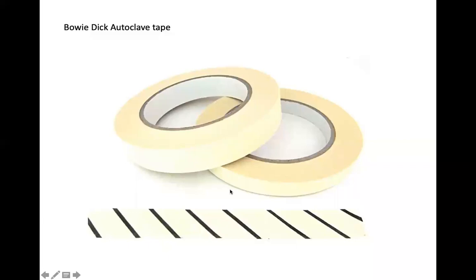And you use this, if you've gone through theater, or if you have not, if you get a chance to, you will see certain items that have this tape around them. So this is how the tape looks. And it has certain strips here that are heat sensitive. You cannot see them on this, they are white. And that is before the tape has gone through the heat process.